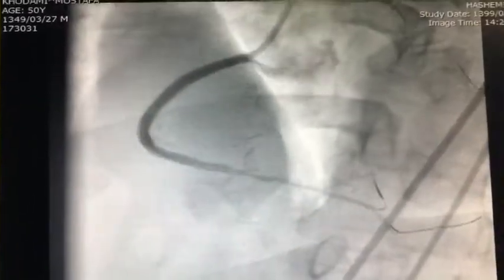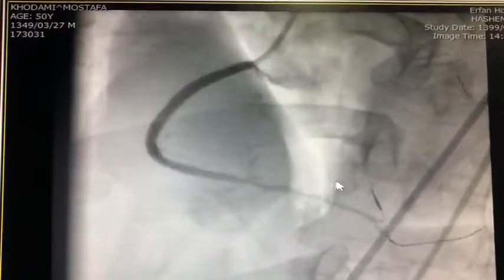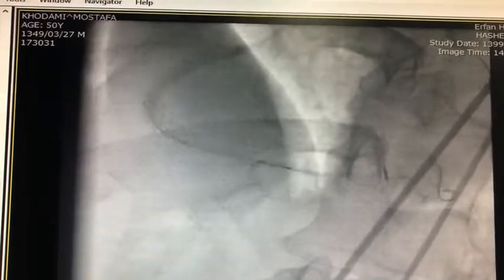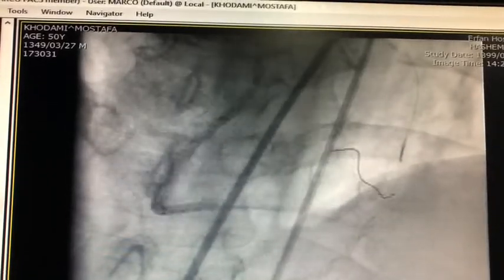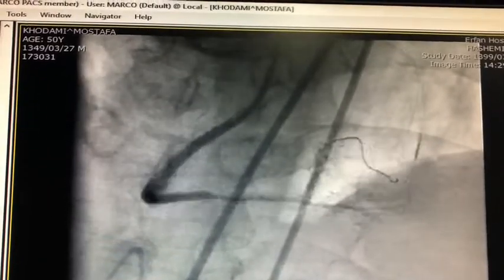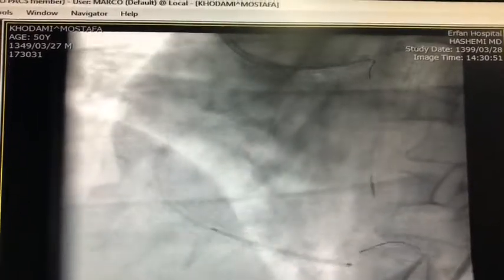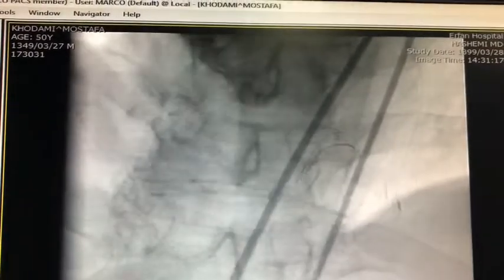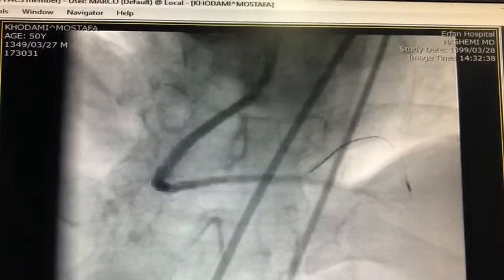So at this point, we used the dual lumen microcatheter again. I think it was Sasuke, to wire this branch, and then did the crossover stenting after predilation and step predilation in the branch. We did the crossover stenting from the RCA to the PDA, and these are the images to see the distal part is good. And after crossover stenting from RCA to PDA, we jailed the wire. So this is where we are at.